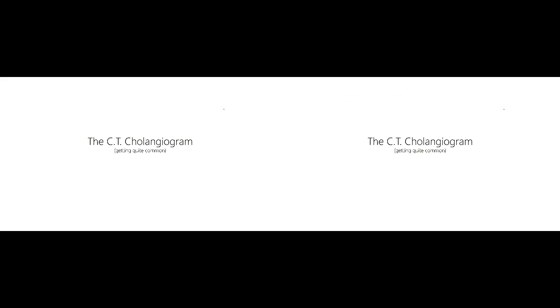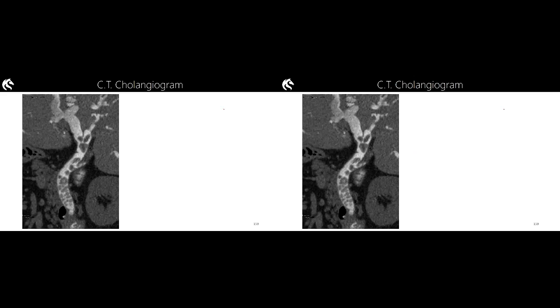Now, a couple of quick things I want you to just be aware of. We can do cholangiograms using fluoroscopy, but there are currently examinations which are starting to grow in popularity, the CT cholangiogram. Okay. Step one, give the patient an iodinated contrast that's likely to be picked up by the hepatobiliary system. Great. What it's going to do is to fill up the intrahepatic ducts and the common bile duct and hopefully even the gallbladder itself. Then we do a CT.